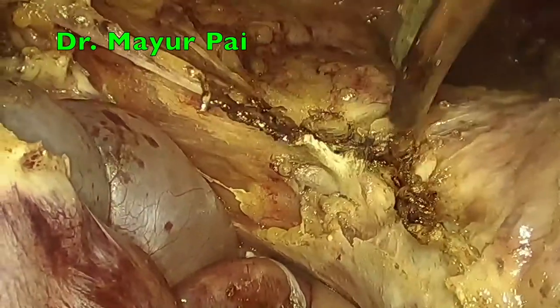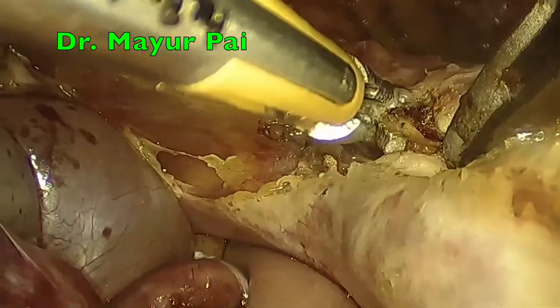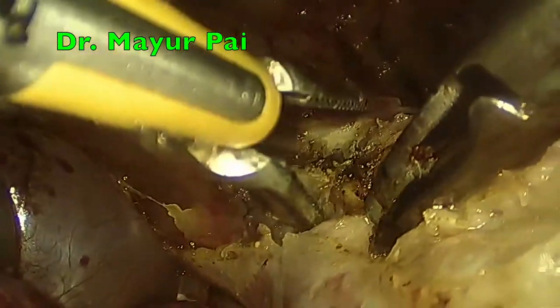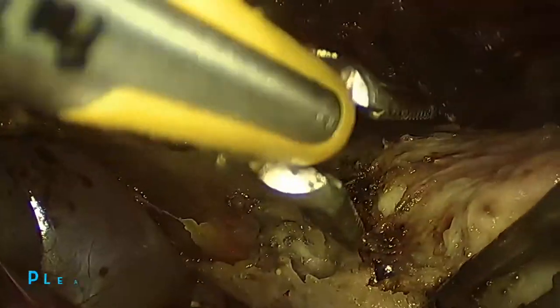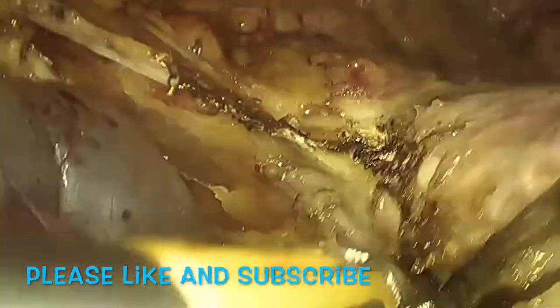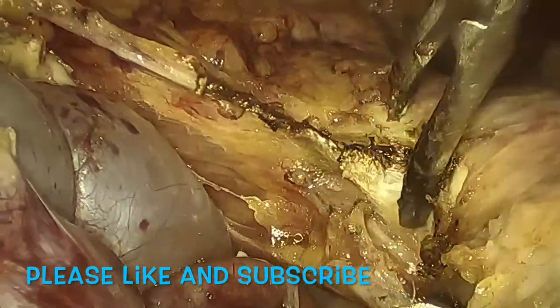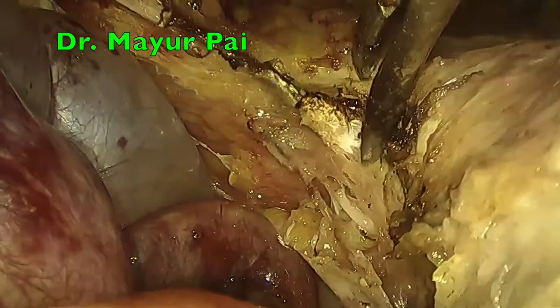Here you can see that the uterine vessels have been coagulated, and using the laparoscopic shearer, we are doing the cutting part of it. As mentioned before, the bipolar forceps on the right hand side, on the left hand side, is on a low current setting that helps in slow cooking of the tissues but a deeper coagulation. Whereas the laparoscopic shearer is used like a scissor, it has more of a cutting function. However, it also has the ability to coagulate. The laparoscopic shearer typically has a high current setting and normally is used in bursts.